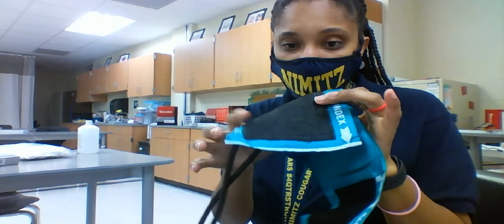A pediatric cuff is probably about this big, and that's it. You would cut this off, and that's what a pediatric cuff would look like. You would have to take a manual cuff on a little baby or an infant or a toddler. Most of the time you just use an automatic for them, or sometimes it's even waived. They don't even try to do it because they're just too flighty.